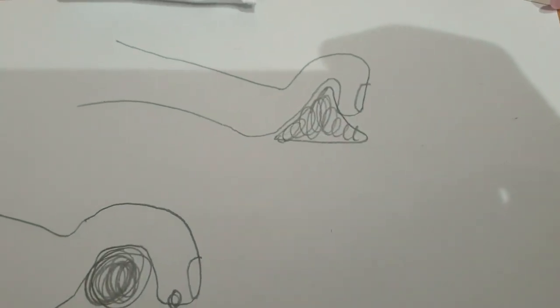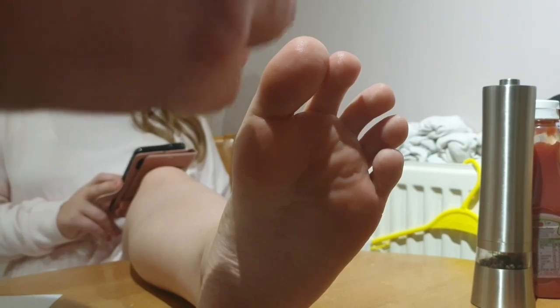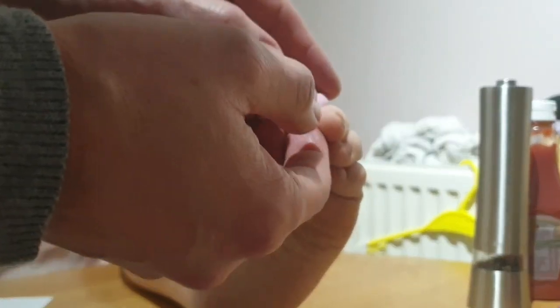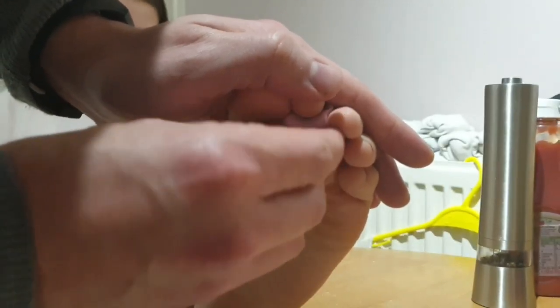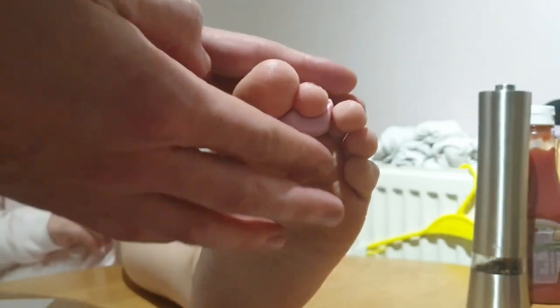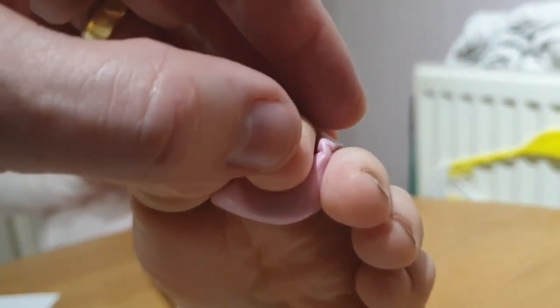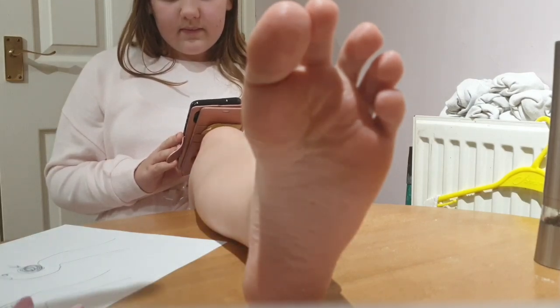Once again we want a nice round one. I'll show you a single and a triple. So a single cradle — make your rough shape before you put it in through there. Of course Eleanor's toes are beautifully straight, and normally you'd be doing this with somebody's toes clawed. You don't want it particularly thick in between, but you do want it thick under there, with a nice rounded shape. That would be a single toe prop.